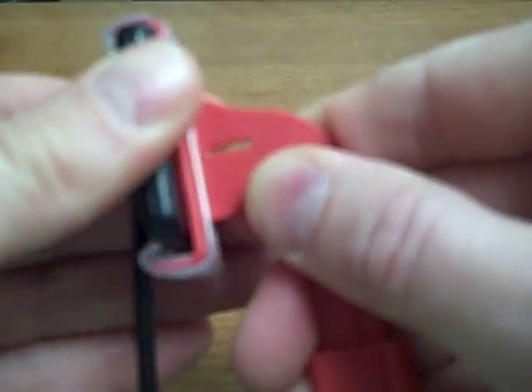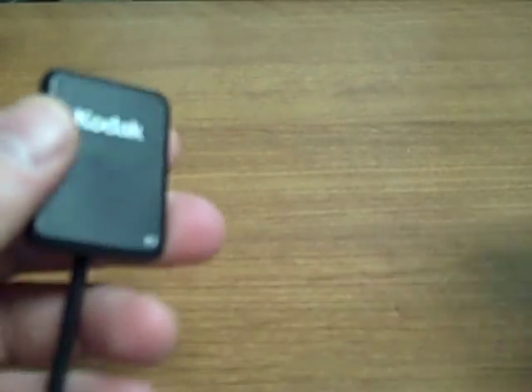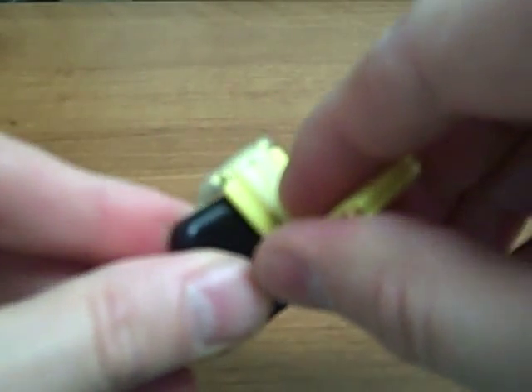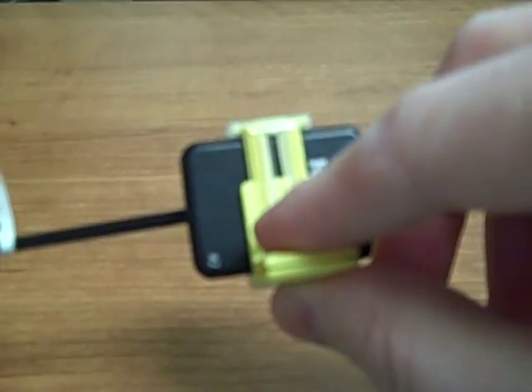Each bite block works with either a size 1 or a size 2 sensor, whichever you would like to use. The yellow bite block is for the posteriors, and you're going to load the sensor in this bite block in the horizontal orientation.